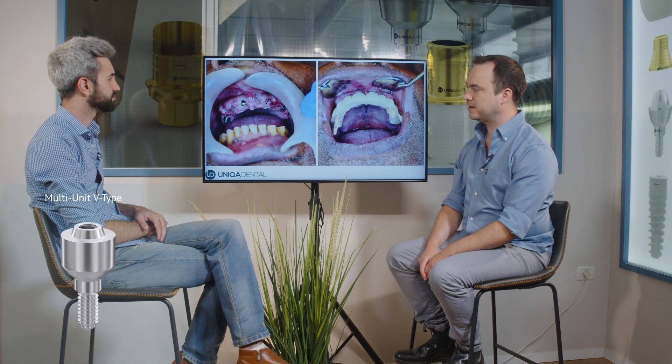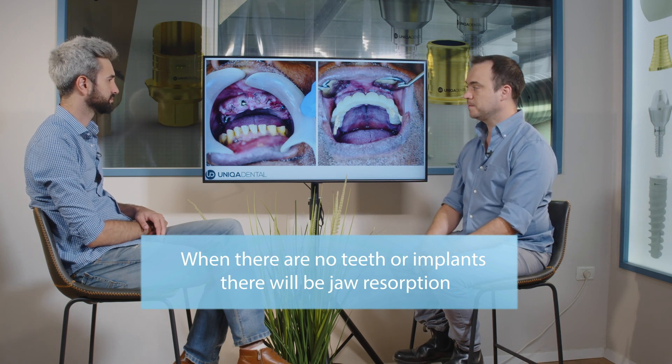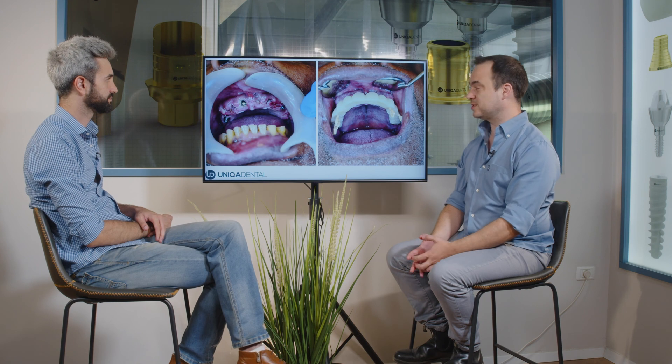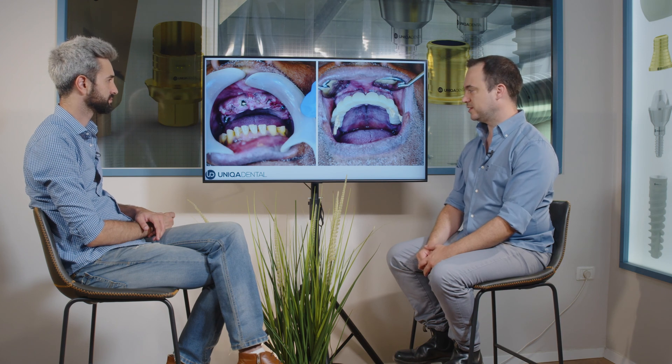You used straight multi-units? Yes, in this case I used straight multi-units because the angulation is not that bad. The old implants were kind of parallel. The new ones not that much, because we had some bone resorption — this place was without teeth and without implants for a long time. In the maxilla, the buccal part of the bone resorbs a little bit and the angulation goes buccal. You can see the implant here is going way to the buccal side. Because it's a posterior implant, it's not that much of a problem. In the future we can change the straight multi-unit to an angled one. Right now it's still a temporary restoration — you need to wait for the gingiva and the swelling to recover before continuing.